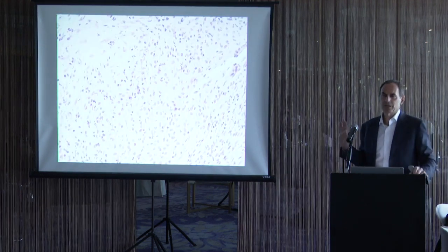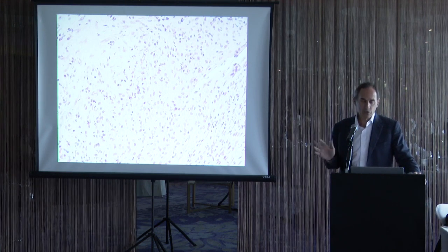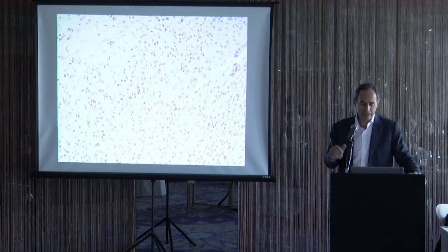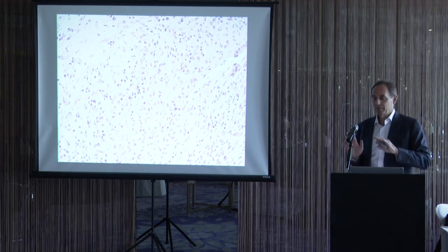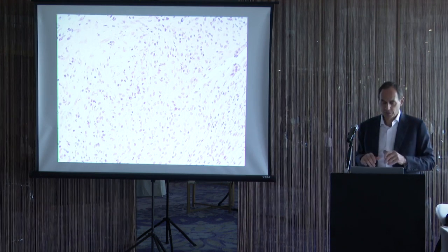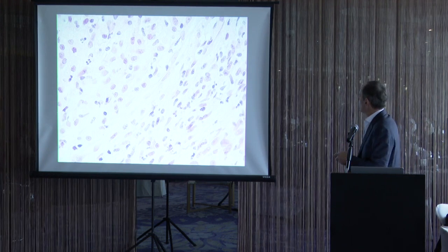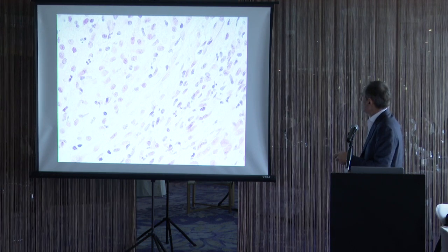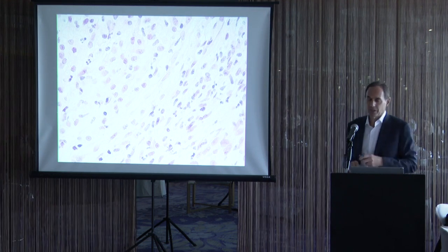But then you come to this epithelioid variant of nonspecific granulomatous prostatitis. It looks very different from the other examples I showed you that look more overtly inflammatory. And if you're not aware of this variant, it looks extremely like cancer. I mean, you could look at this and start using your imagination and saying these are poorly formed glands, there's some nucleoli in here, and you're on your way to misdiagnosing this as a high-grade prostate cancer.